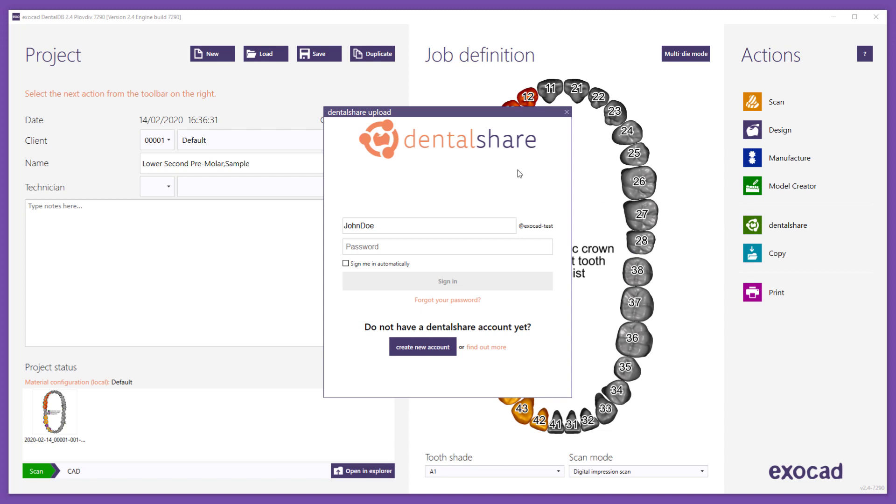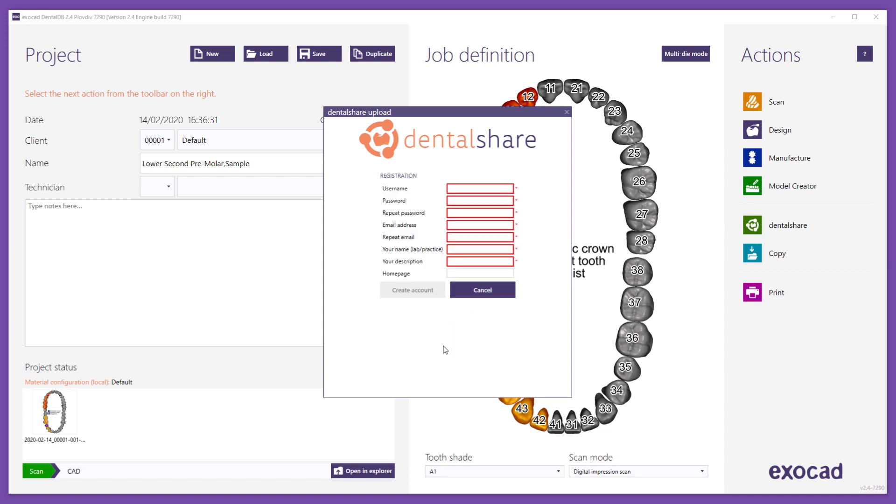Click Create new account. The registration form appears and the required information needs to be entered. Fields with a red frame are mandatory.